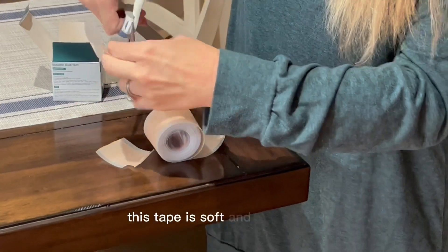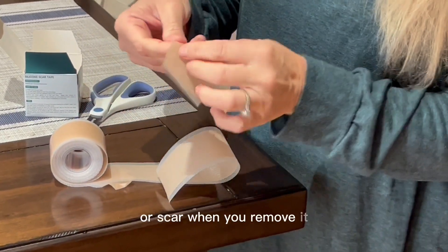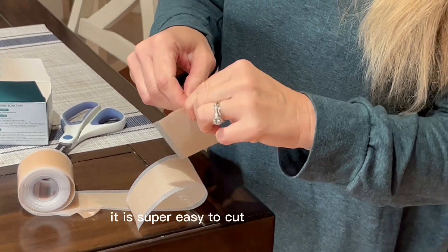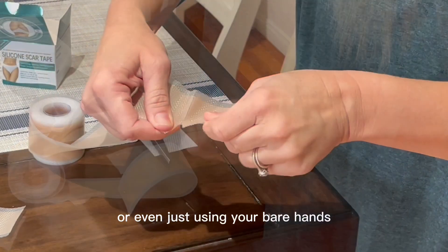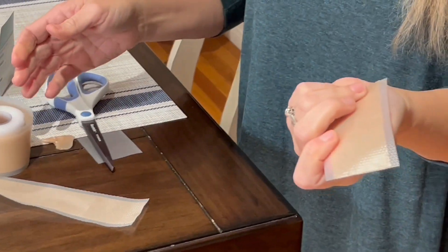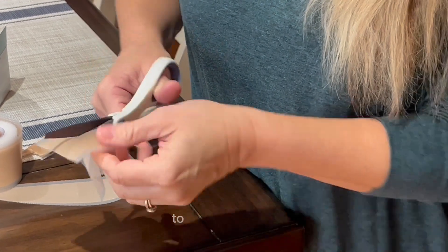This tape is soft and breathable and will not damage your skin or scar when you remove it. It is super easy to cut using scissors or even just using your bare hands, and it can be cut into whatever size or shape you need to cover the scar.